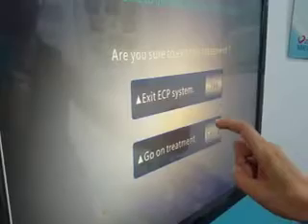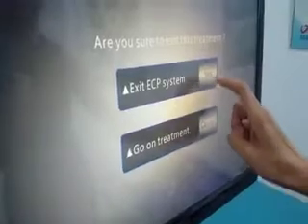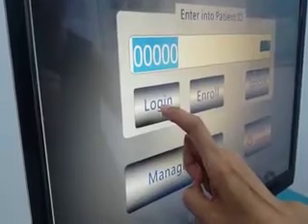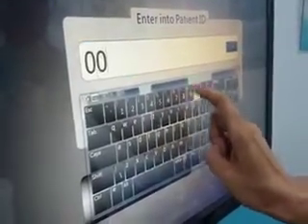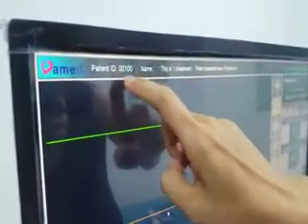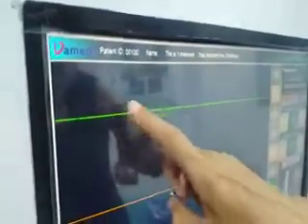If this is not a new patient but a returning patient who came before, we log in using the old ID number previously assigned. For example, this returning patient has ID number 00100. After logging in, their ID number is displayed and we can review all their previous database records.